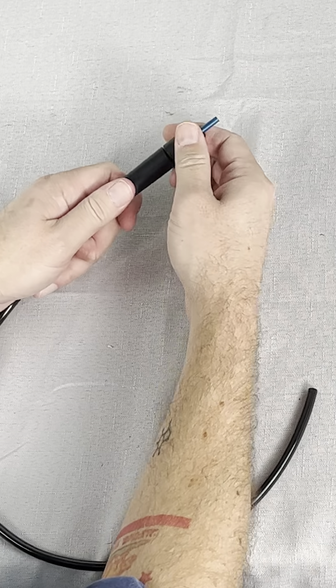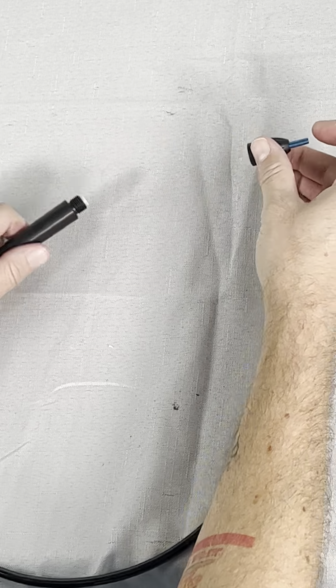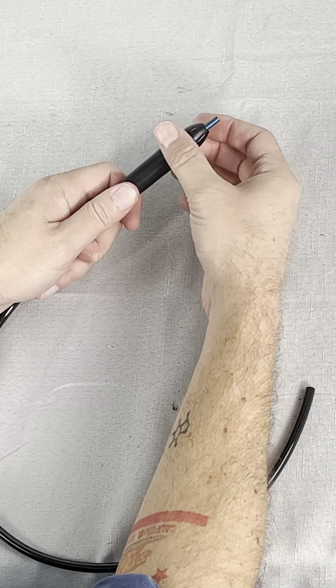If you're just replacing the tip or an o-ring, you'll only need this first part. Unscrew the nozzle cap and that's it — your tip and o-ring come right out. You can insert the new tip and the new o-ring behind it and screw the nozzle cap back on.